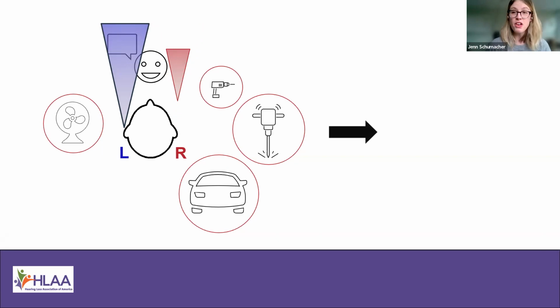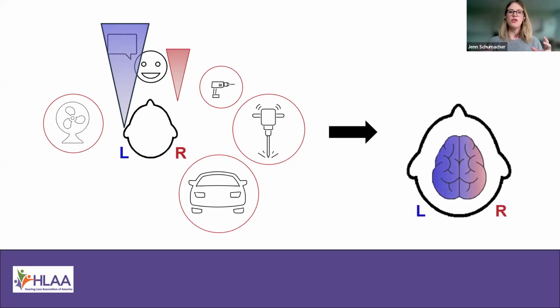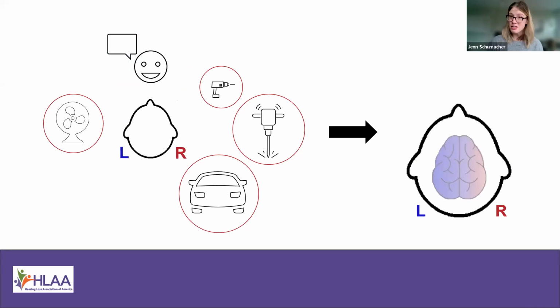So then once all that sound is amplified and sent through the loudspeaker and your brain captured it all, you're actually hearing more of what's going on the left than you are from the right. So it's like we're letting in even less sound than we would with a normal directional microphone, if that makes sense. And because, again, your brain hears this all as one cohesive picture, it doesn't sound necessarily unnatural. It's able to take advantage of the fact that the left side is a little less noisy. And then because it is noise, we've got those directional microphones working to reduce the noise from that as well, so that you hear a little bit less noise overall.